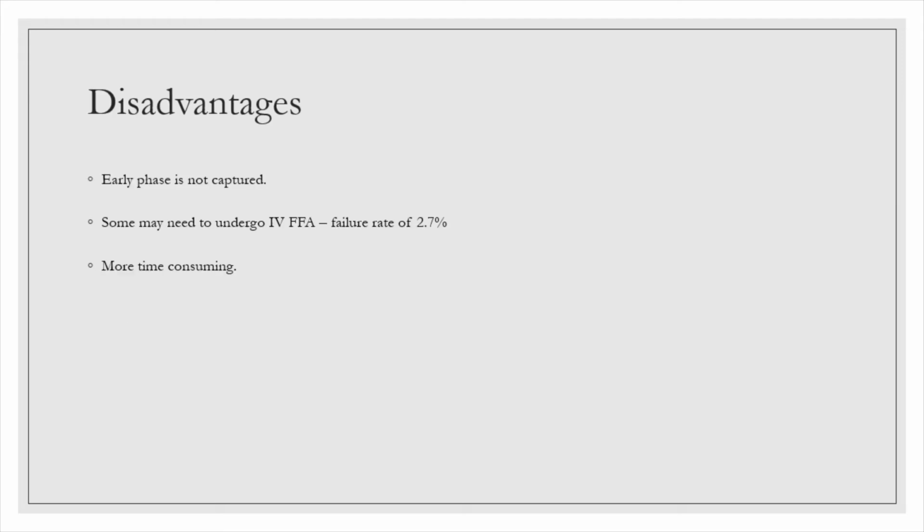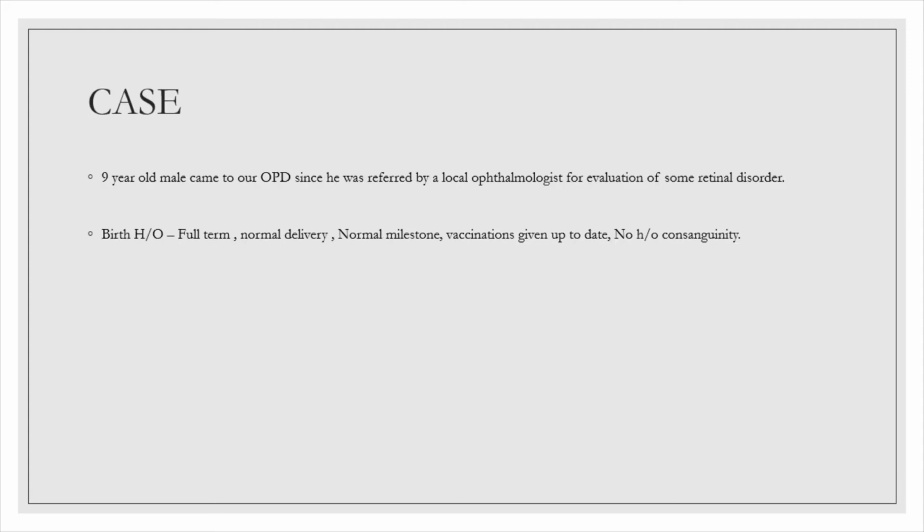The disadvantage is that the early phase is not captured, and around 2.7% of the patients require another study, because that's the failure rate of the intervention, and it is also more time consuming. So this brings us to my case.